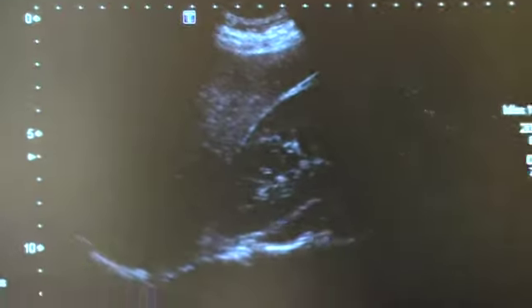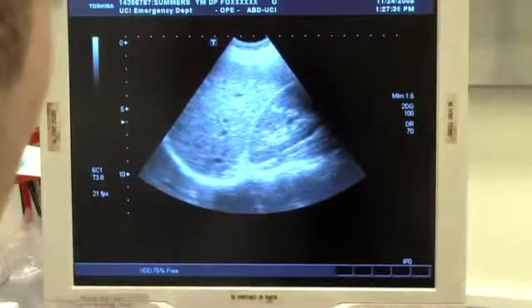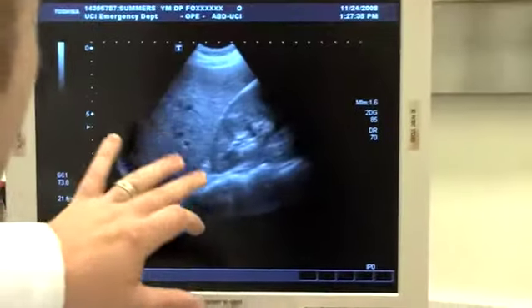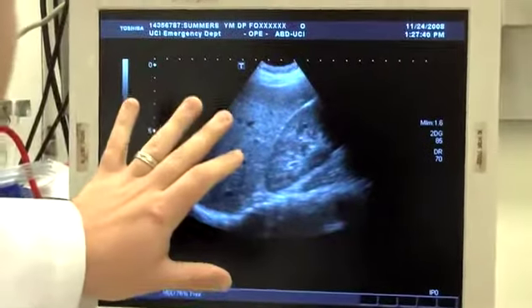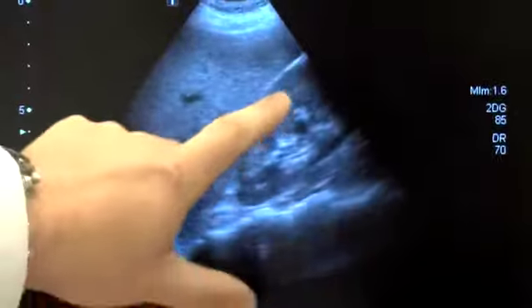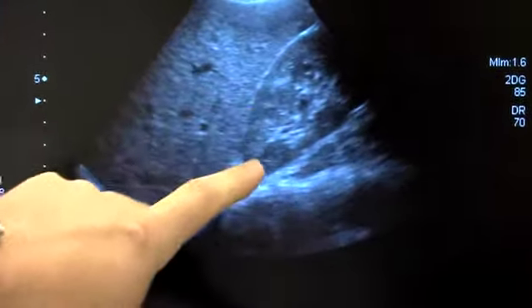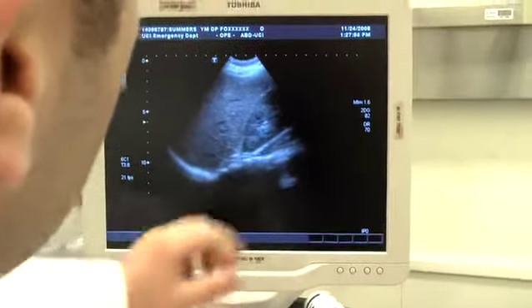The screen uniformly dark. If you turn it way up, the screen is going to be uniformly bright. The right amount of gain would be somewhere between where the liver parenchyma has a slightly increased echogenicity compared to the renal cortex. So you can see how the renal cortex right here is a little bit less bright or less echogenic, as we would say, than the liver parenchyma. So this is probably the optimal gain setting right about there. When you're doing a FAST scan, you're looking for fluid in this pouch, Morrison's pouch, in the hepatorenal recess.